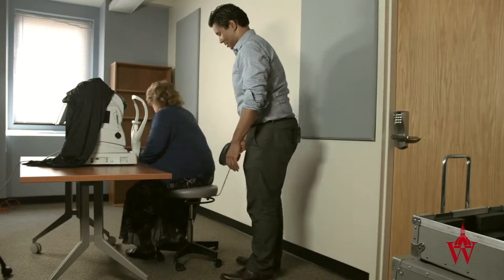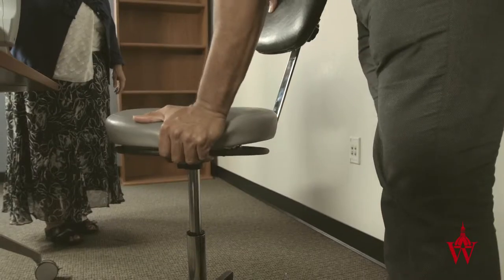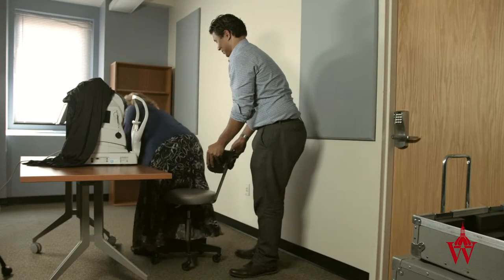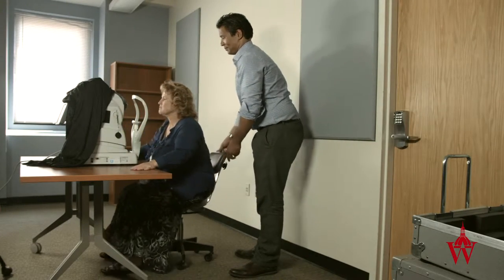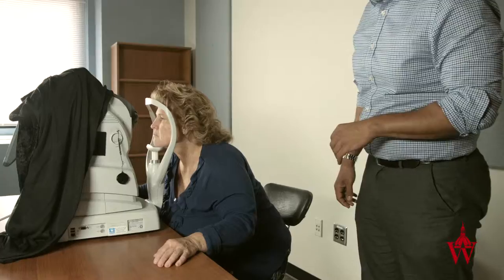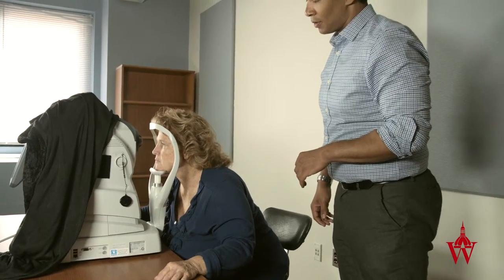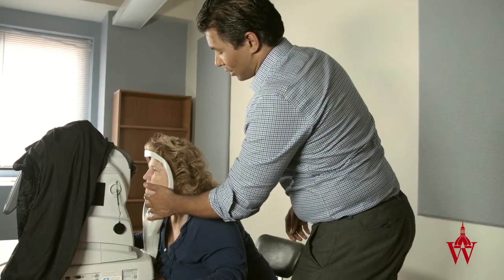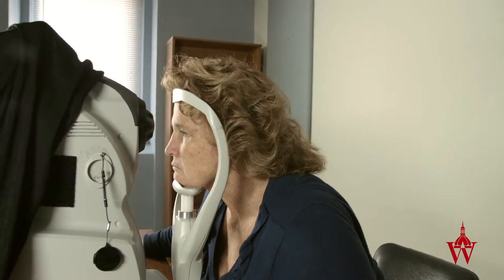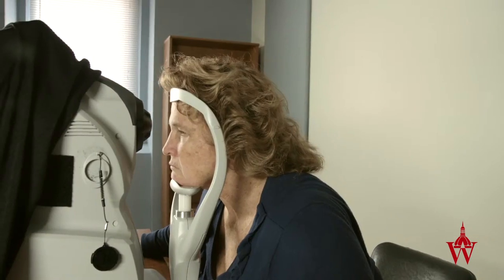If the chair is too high or too low for the machine, instruct the patient you will either lower or raise the chair if it is adjustable. Otherwise, ask the patient if they would mind switching chairs to create the optimal height for the machine. If the patient doesn't press their head firmly against the chin rest or head rest, instruct them to make sure their chin is firmly placed on the chin rest and their forehead is all the way pressed against the bar.